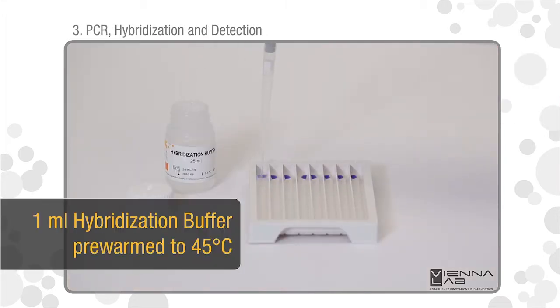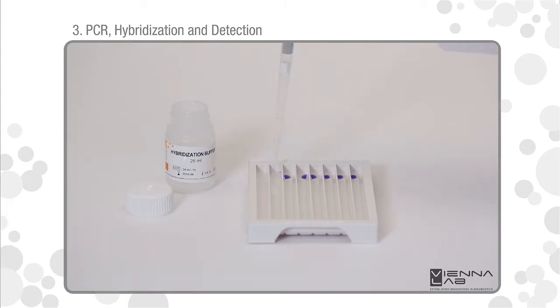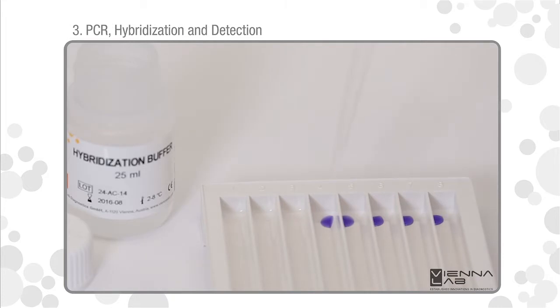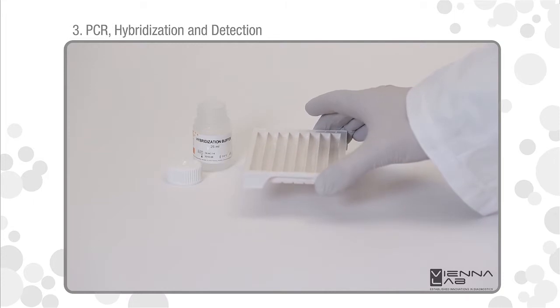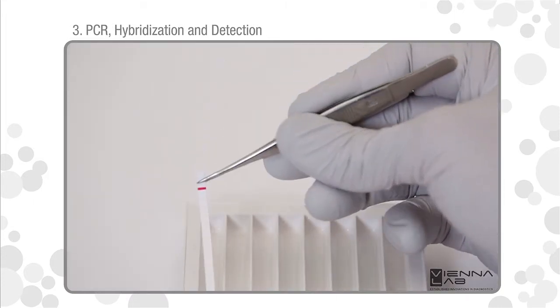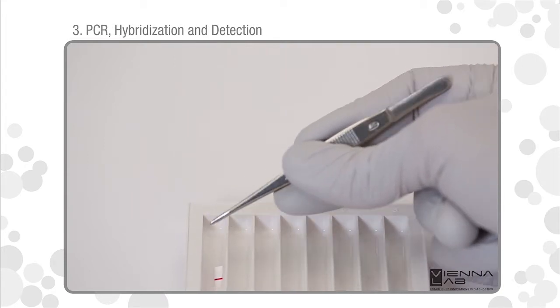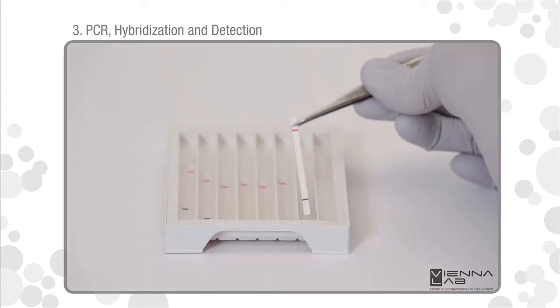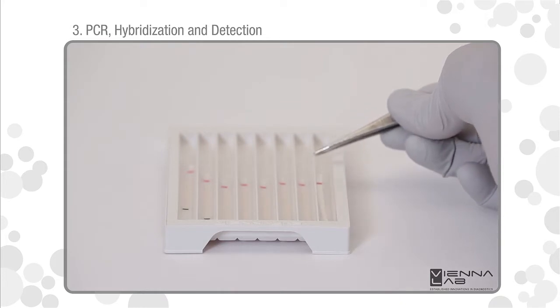Add one milliliter hybridization buffer into each lane. The blue color will disappear. Gently agitate tray. Insert test strips with marked side up into the respective lanes. Submerge test strips completely. In order to avoid cross-contamination, do not dip tweezers into solution.